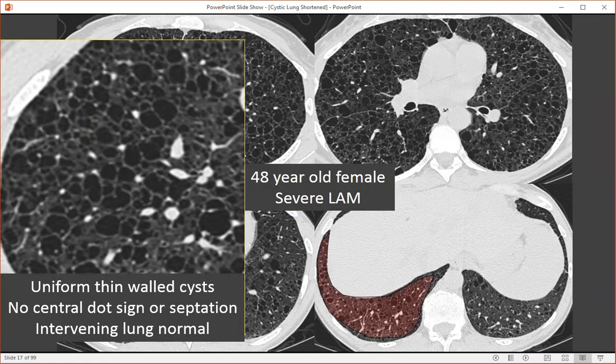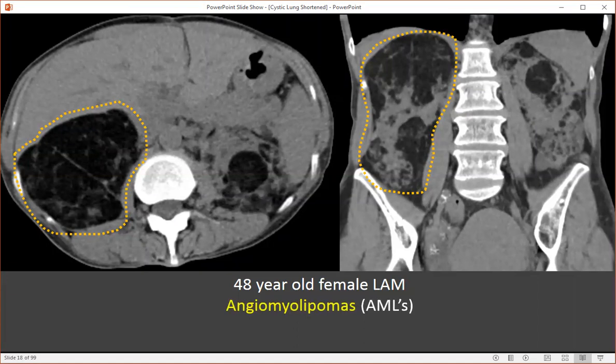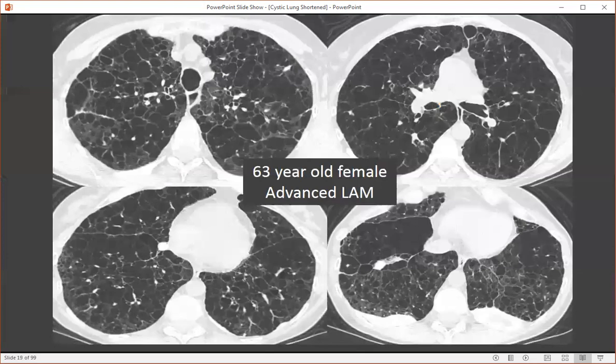Also notice that this is a diffuse disease, and therefore it will involve the costophrenic angles. This separates LAM from pulmonary Langerhans cell histiocytosis, which often spares these areas. In this person's upper abdomen, we can see that the kidneys are largely replaced by fat-containing lesions characteristic of associated angiomyolipomas. These can occur within the kidneys, liver, retroperitoneum, or posterior mediastinum.